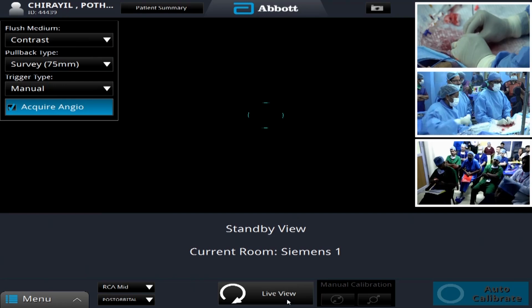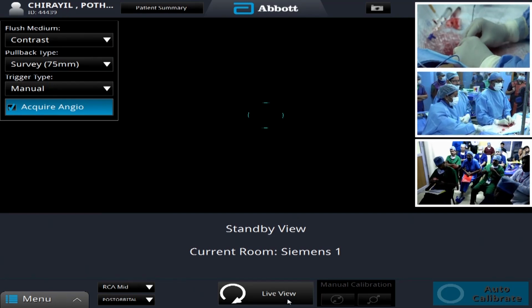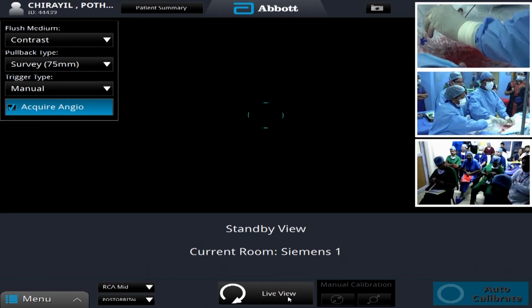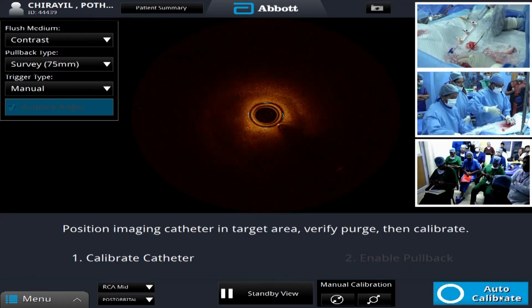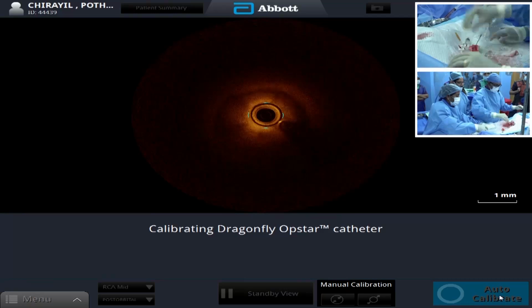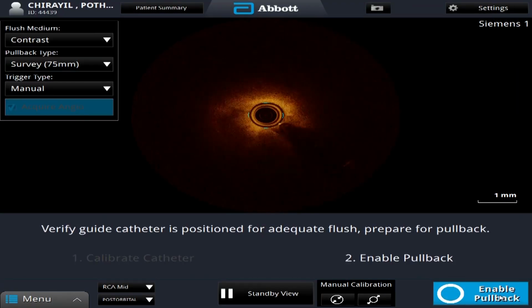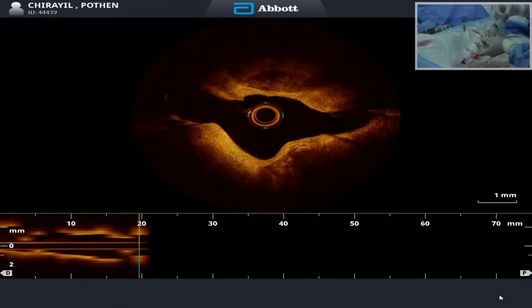Come closer. We are ready. Show the image. Activate.